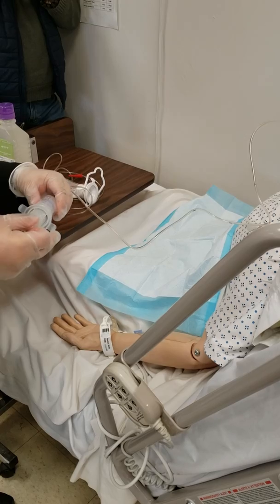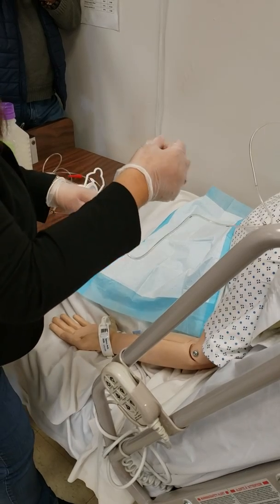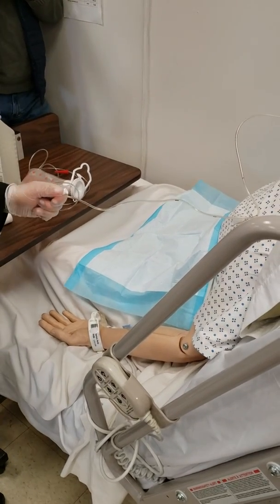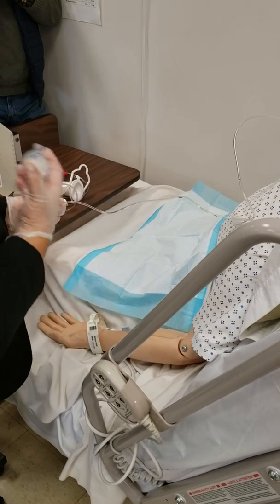If I really did not aspirate anything, it could be in the lungs, so I will ask for an x-ray to make sure. I won't give any feeding, of course. I will not give the feeding and inform the physician.